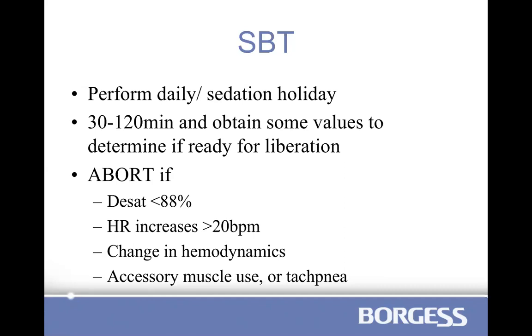And obviously only do these if the patient is a candidate for extubation. If they are paralyzed, for instance, they're not going to have a spontaneous breathing trial. If they are prone, probably not going to have one. If they are on 3 pressors, not going to have one. But as the patient is recovering from their insult, you want to see if they're ready. And the only way to see if you're ready is to test it every day.